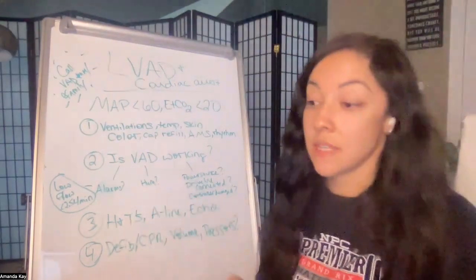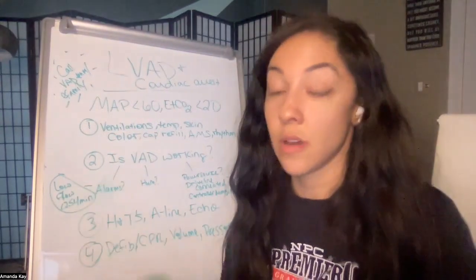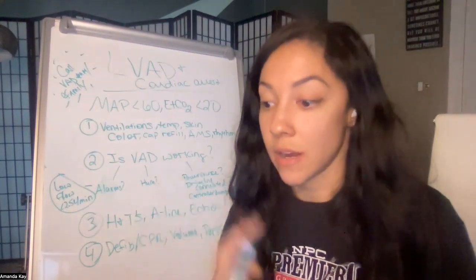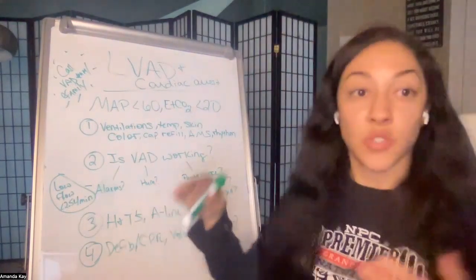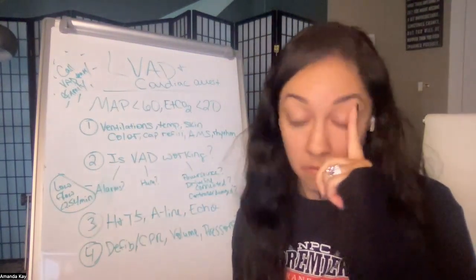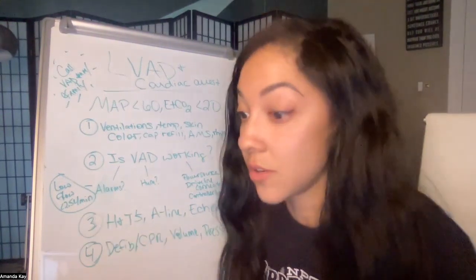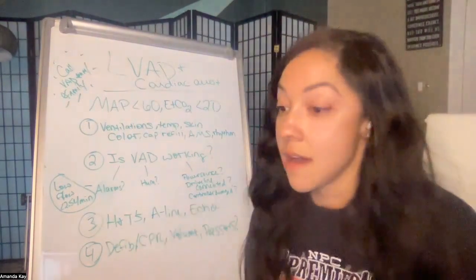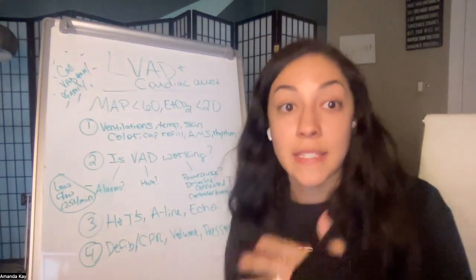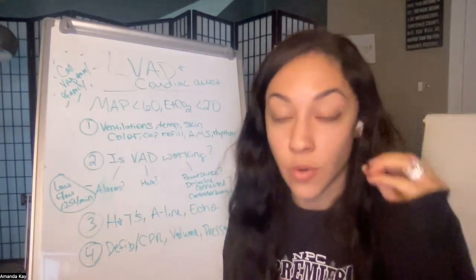So H's and T's, going through all the things, especially if you see a low flow alarm: hypovolemia, are they bleeding, right? Are they hemorrhaging somewhere? What is the source? What is their INR, their clotting levels? What is their H&H, especially what's their crit, right? What are we looking at here? Tamponade, pulmonary embolism, pneumothorax. Has there been some type of trauma to them, right? You're still going through all of those things.